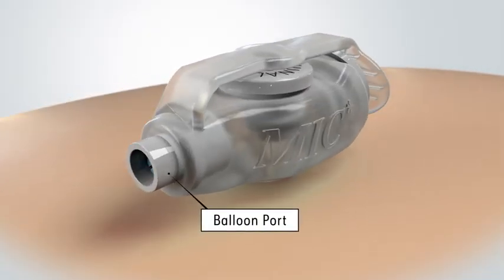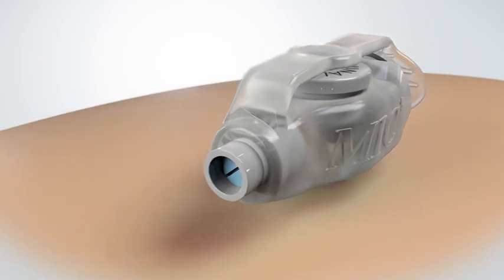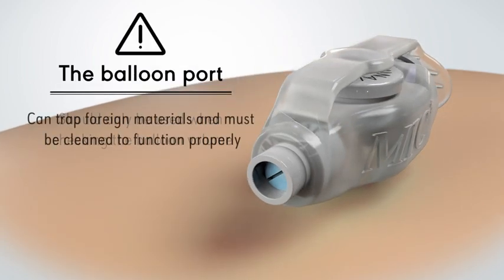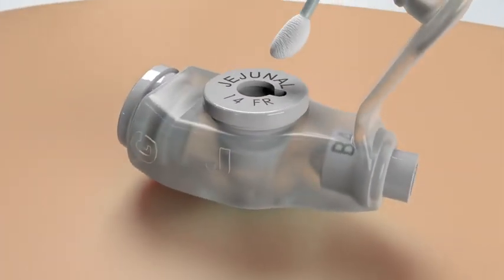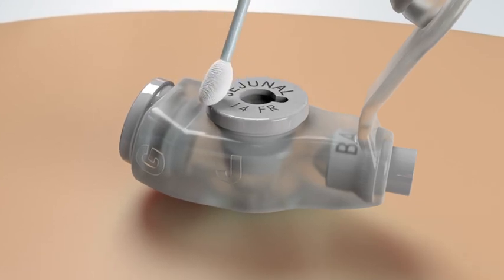Check that the balloon port is clean and dry. Using a soft cloth or cotton-tipped applicator, clean the outside of the feed head with soap and water.